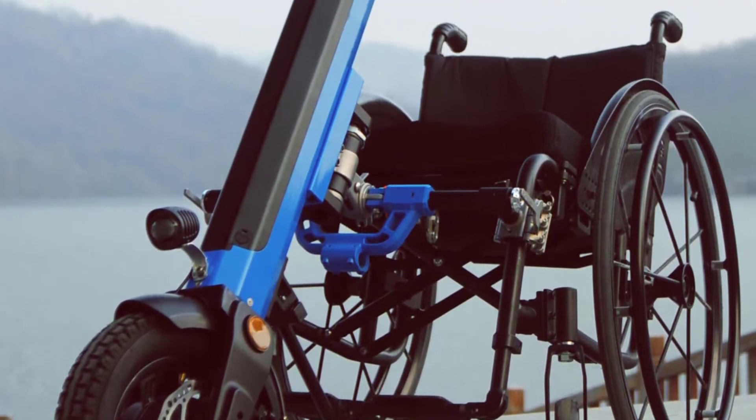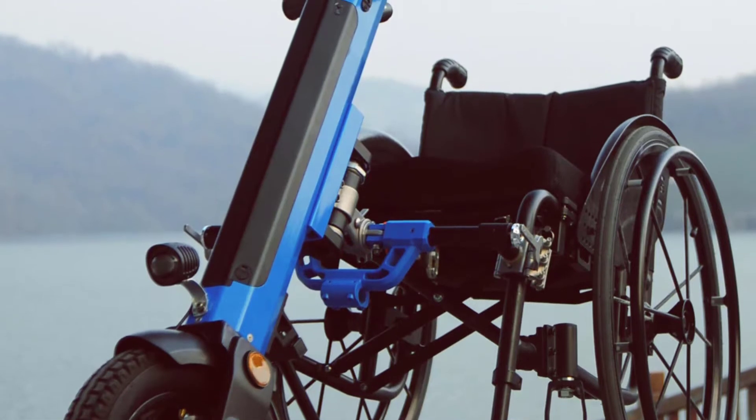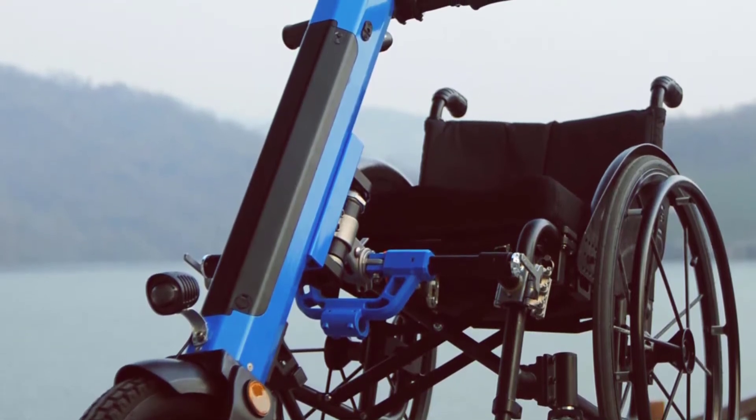Warranty: 2 years. Brake: disc brake. Driving range: 50 km to 60 km.